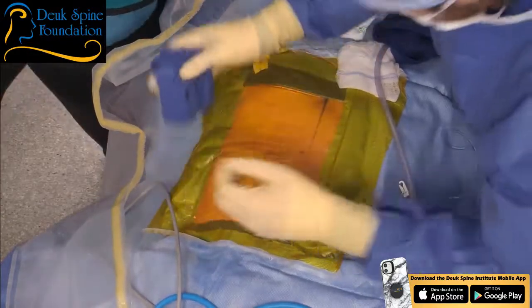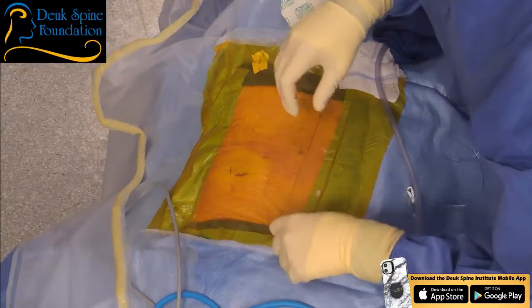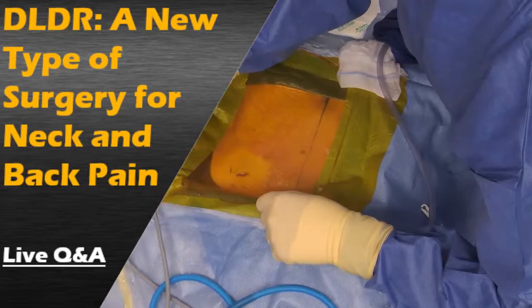Yeah, it's pretty amazing. Endoscopic spine surgery. If you had told me I'd be doing endoscopic spine surgery as a resident at Shands, I wouldn't have believed it. I'm going to call the EBL 2 mil. No complications.